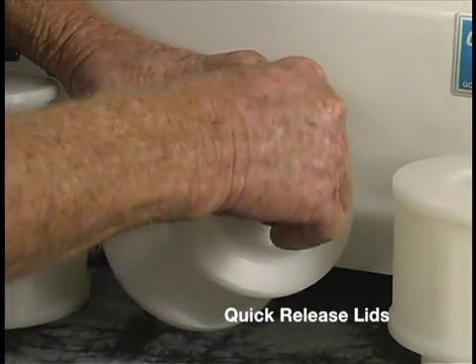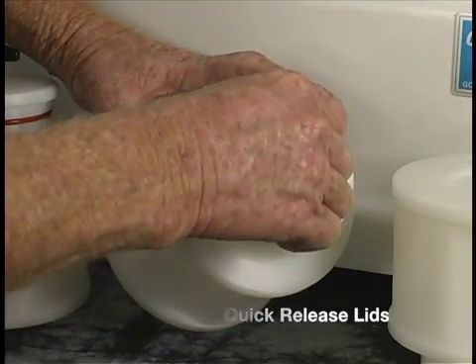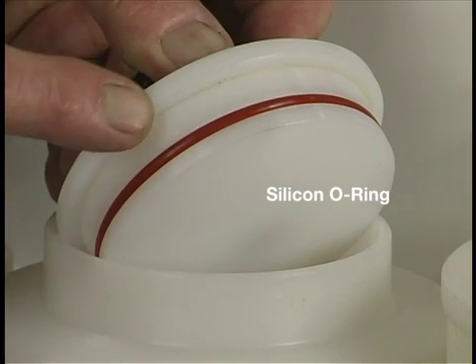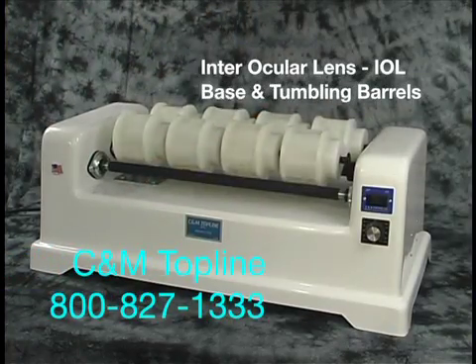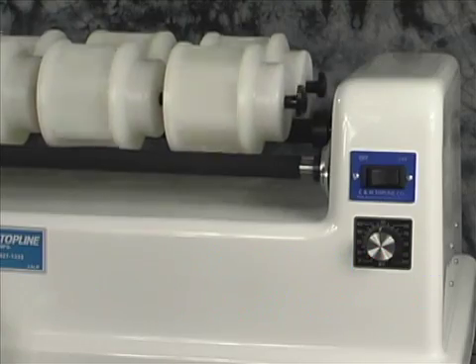The lids are quick release and tight fitting. They are fitted with a silicone o-ring to ensure a good seal. This machine with the IOL barrels will provide years of trouble free service at a very economical price.